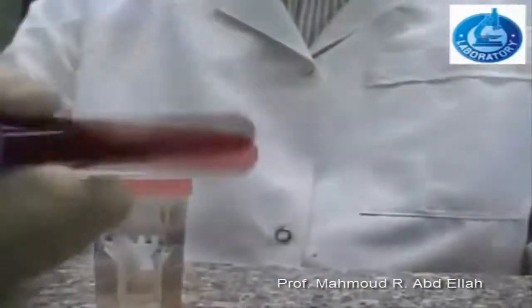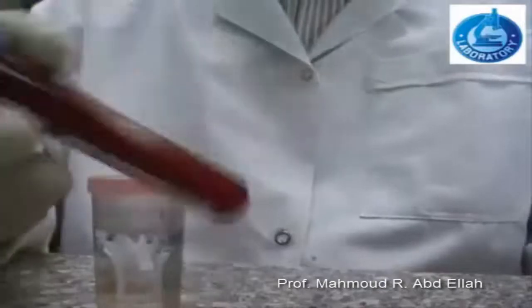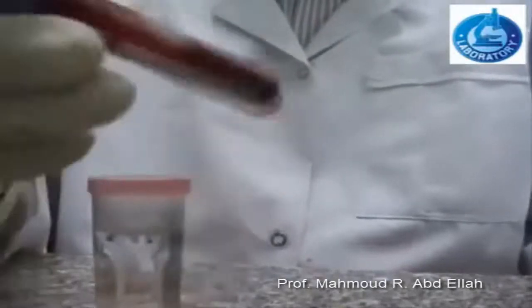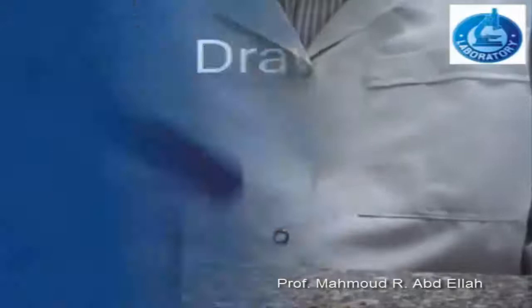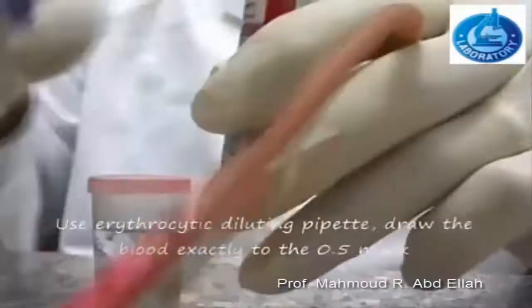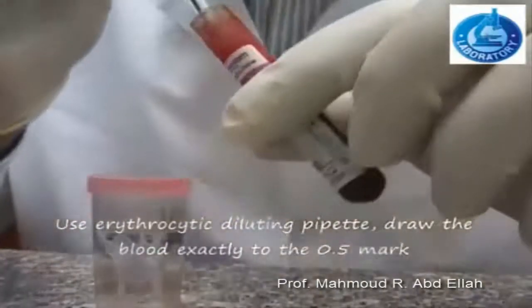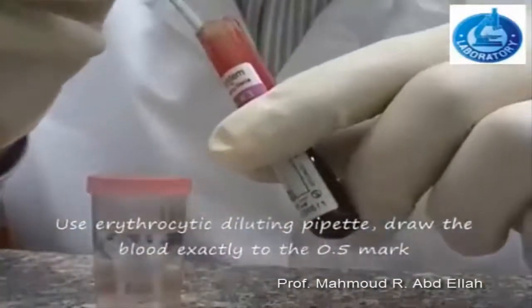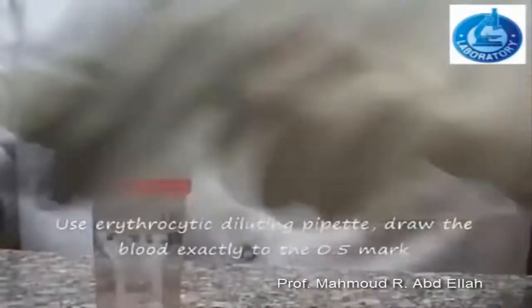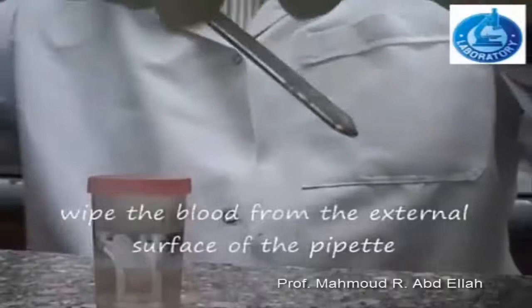Steps for counting the blood cells: first, gentle mixing of the blood sample. Draw the blood sample to mark 0.5, located on the outer surface of the red blood cell diluting pipette.